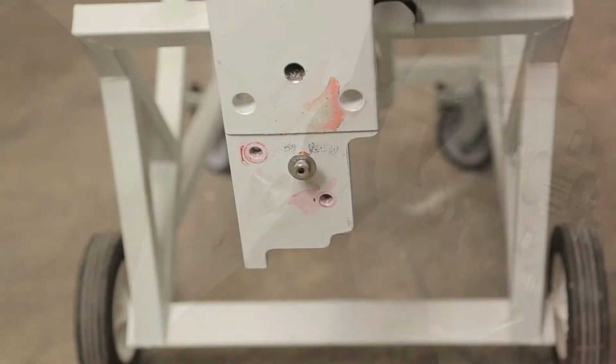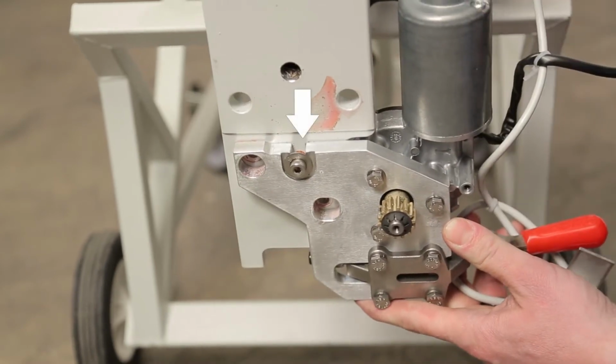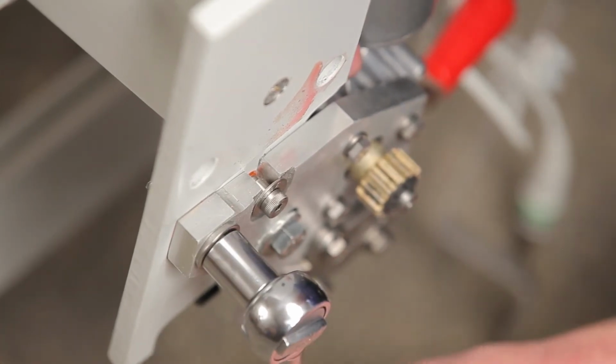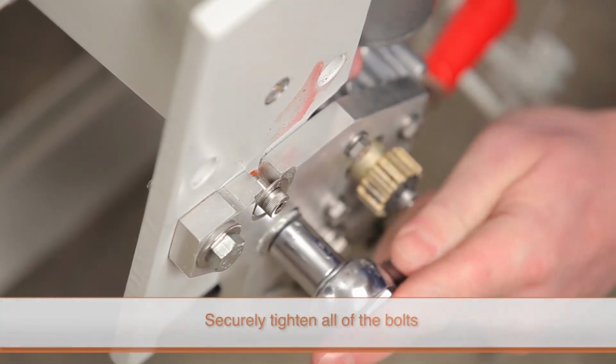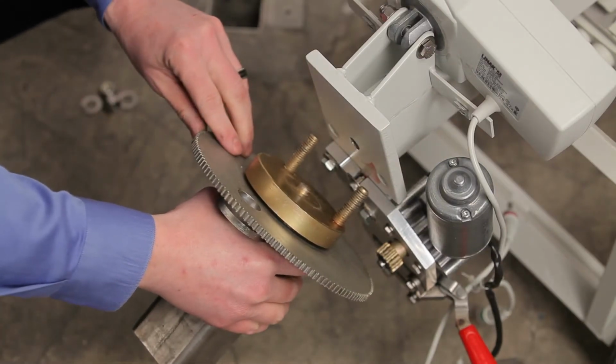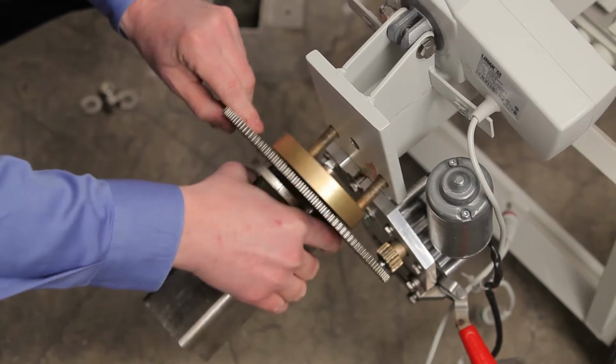Replace the new motor by following the same steps used to remove the old one. Make sure the mounting spacer is in place on the lift base before mounting the new motor assembly and securely tighten all bolts. Reattach the hub assembly and large gear. Make sure to align it so that the mounting studs are oriented closest to the motor assembly.